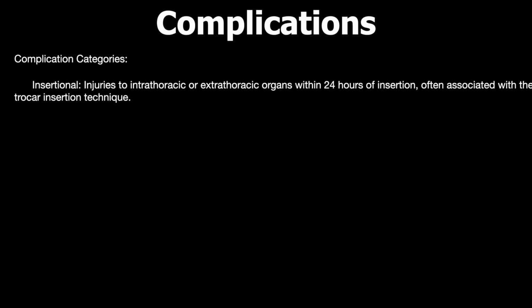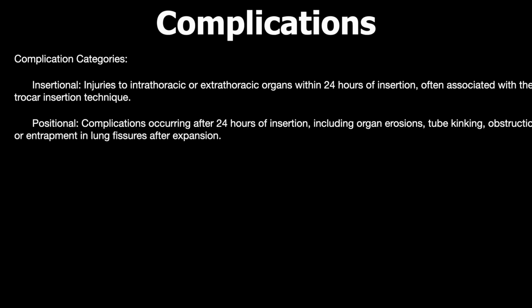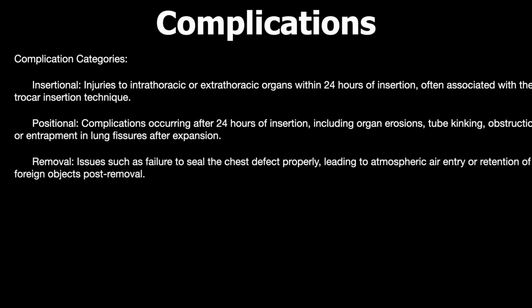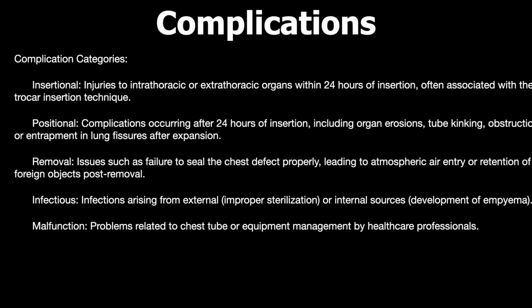Now, complication categories: insertional being injury to the intrathoracic or extrathoracic organ within 24 hours of insertion, often associated with the trocar insertion technique. The positional is a complication occurring after 24 hours of insertion, including organ erosion, tube kinking, obstruction, entrapment after expansion. Removal: issues such as failure to seal, leading to atmospheric air entry or retention of foreign body post removal. Infectious arising from external or internal sources. Malfunction: problems related to the chest tube or equipment functioning.